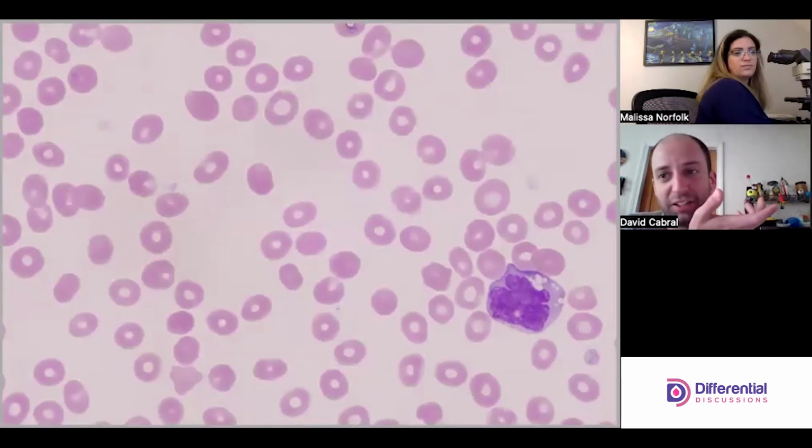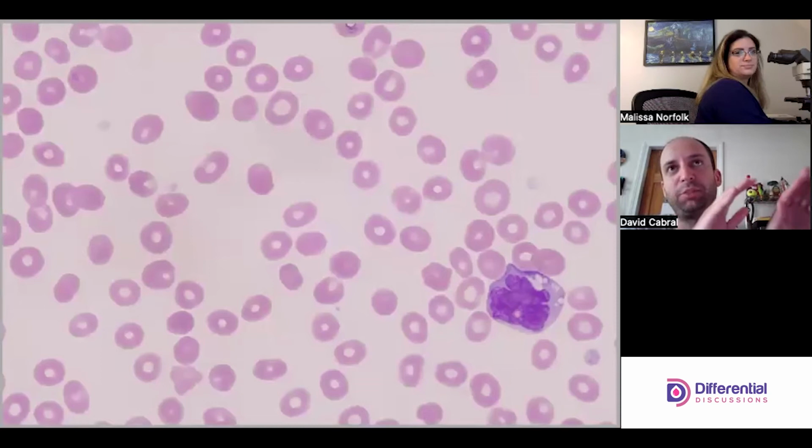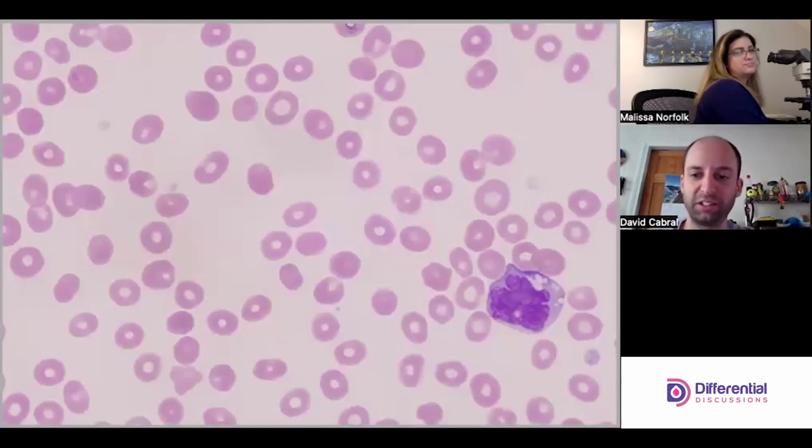So normal cells, right? Like you're gonna come across normal cells. And then this is especially dangerous when we talk about weird butterfly nuclei or whatever, but this is just a monocyte. Yep. Literally just a monocyte. So try not to overcall, I guess.